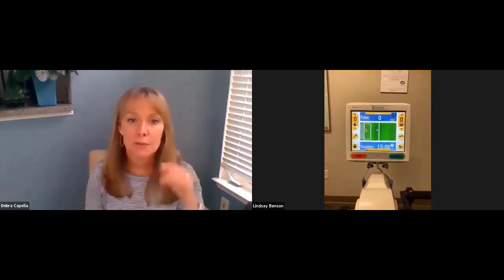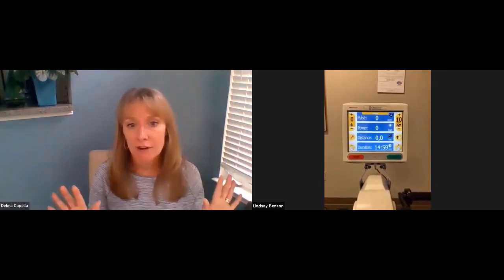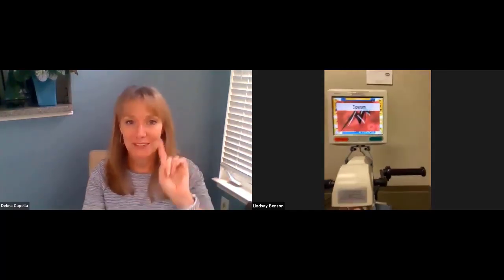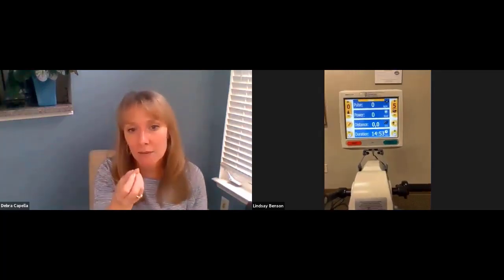Perfect. So now we're going to hit start. And what I want you to see here is she doesn't have her hands on this machine. I'm assuming, is it unlocked? Lindsay, did you have the arms unlocked? Yeah. Sorry, hold on one second. There's that spasm piece I showed you about. She has to unlock the arms, right?